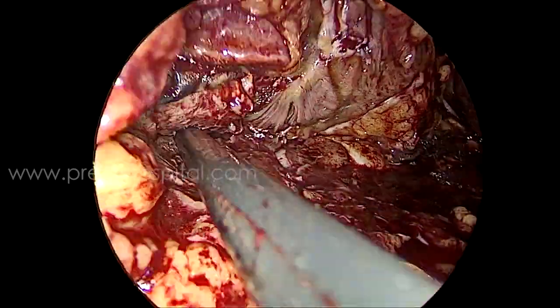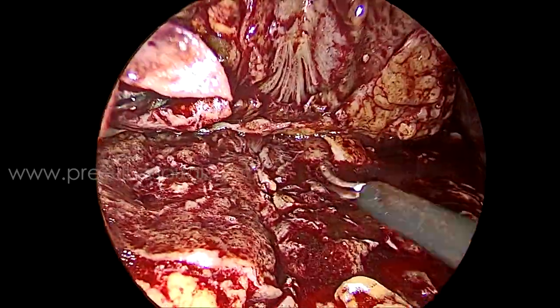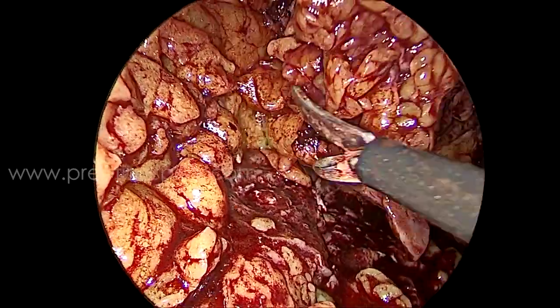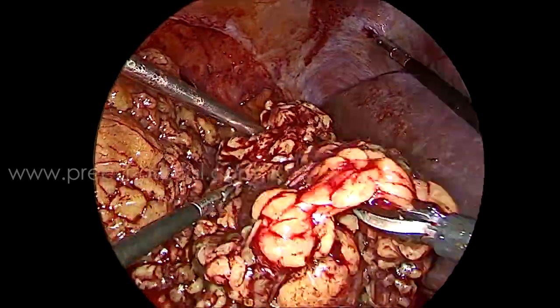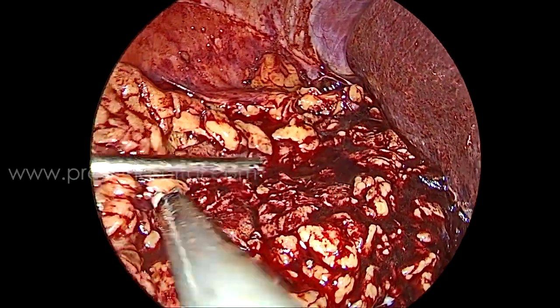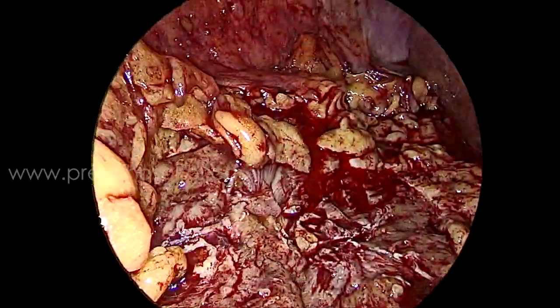The complete deep cut goes up to the sinus fat. You can appreciate the thickness of the fat nicely. You have to cut it separately like at the hilum — see this thickness. This yellow toxic fat could not be separated. The surface is smooth, no problem. Can you imagine how small the parenchyma is to suture with the kidney center buried in fat?